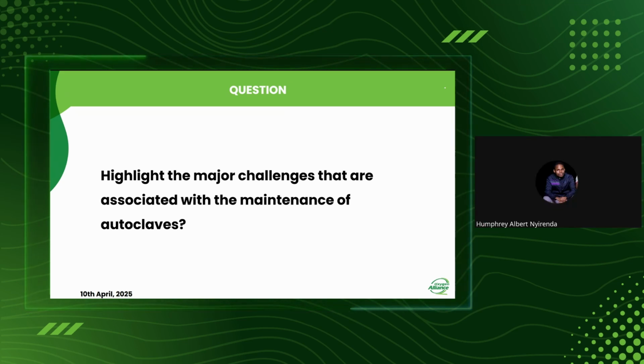Thank you very much. From the explanation that she has given, according to her experience, it is quite evident that the autoclave had an issue with the relief valve. Normally, the program modules are given different programs which come with preset pressure and temperature, according to the sterilization program that you've chosen.